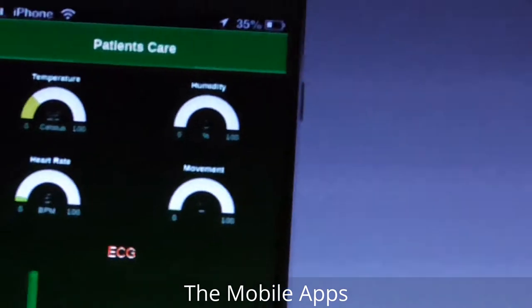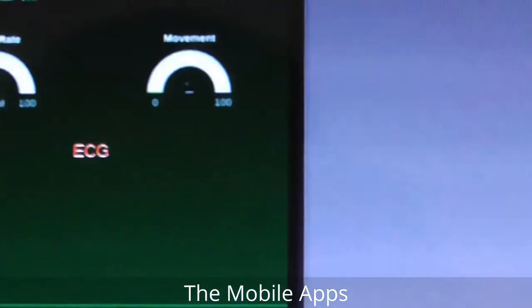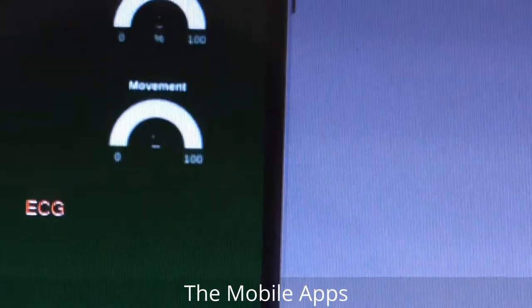The humidity goes to zero when I remove my finger, so humidity works fine. Let's check the movement — okay, the movement value is changing.